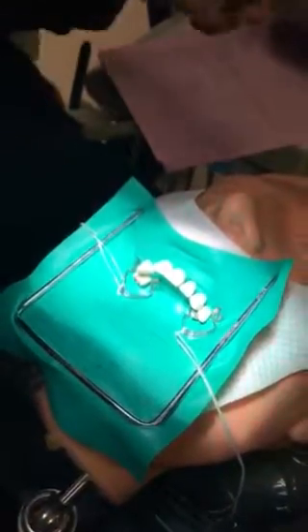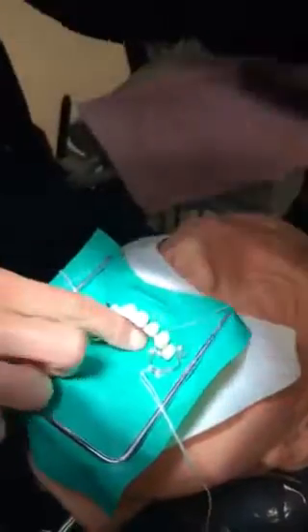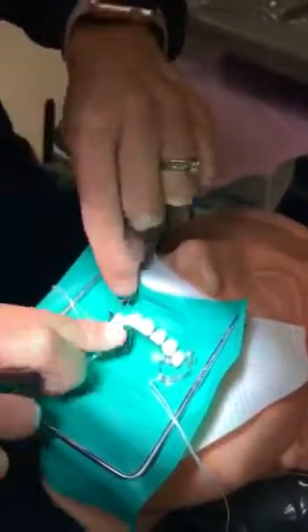Okay? And remember, before, sorry, I shouldn't have said that. We still have some more work to do. We need to floss down our interproximals. Okay. Got ahead of myself. This is all the same. The only thing that was different was putting those clamps on. Okay. So what would you be doing to remove the clamps? The clamps just hold, it's just more stability, just to hold the dental dam.